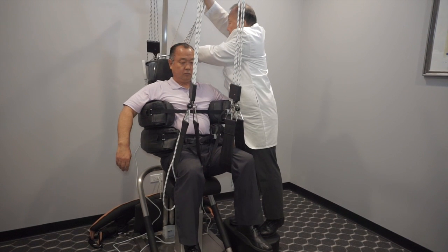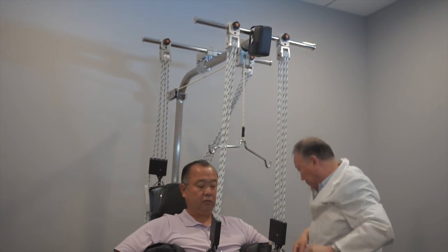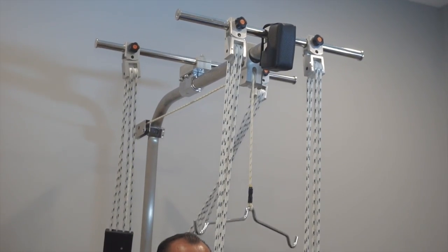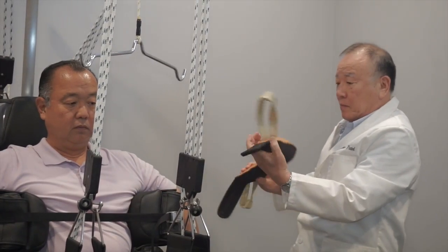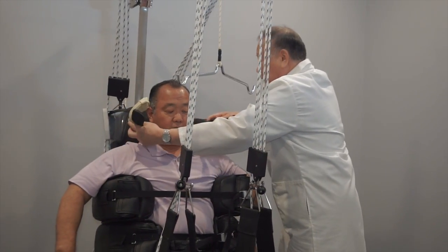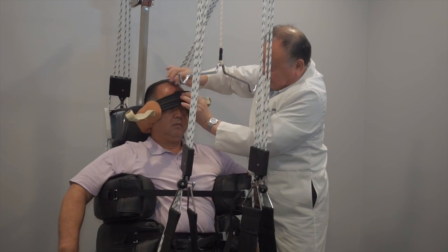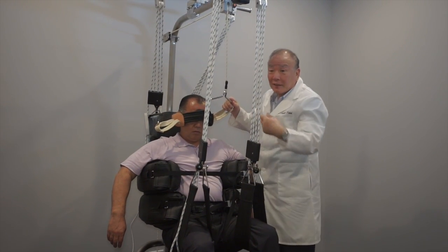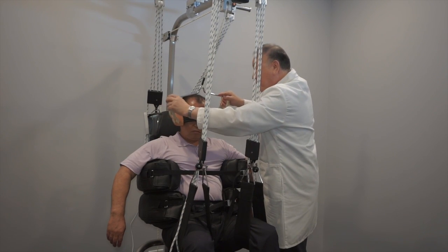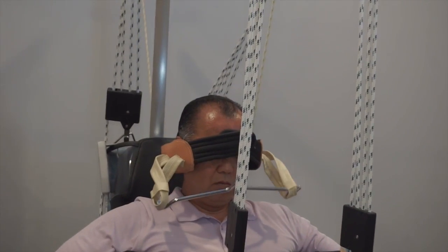Neck cervical therapy. Get the cervical hook in place and adjust the angle by moving the top horizontal lever. Put on the cervical strap around the patient's head. Attach the cervical strap to the hook on each side. Apply the weight by pulling up the weight lock device.